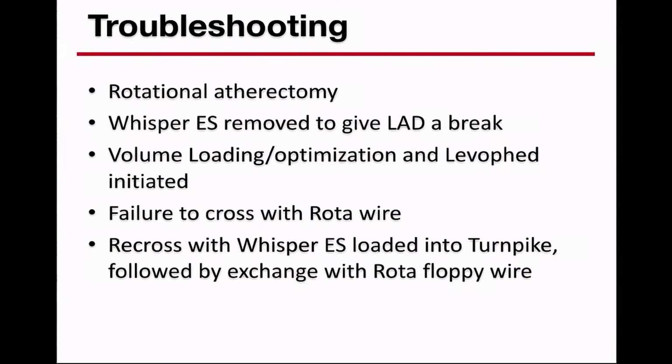They start to pee like hell. And then surprisingly your filling pressures go down, and you need to fill, and the only way to manage it properly is with a Swan-Ganz. So that's maybe one learning point in that case, is that once you have that, you can optimize your support. I think also using the echo in measuring the IVC was a very good indicator, and it kind of helped us here.